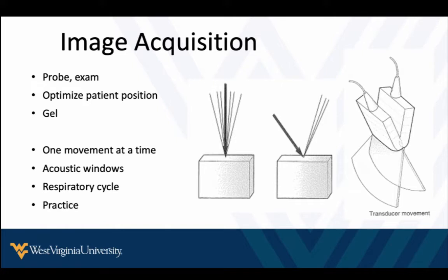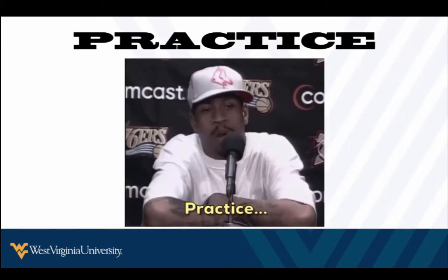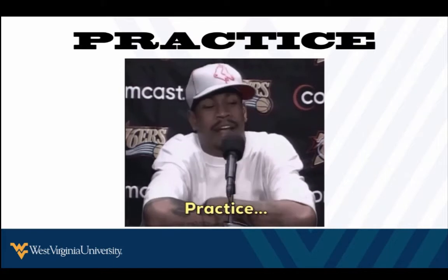But the most important thing is this is a procedural skill, and it's like any other procedure. A lot of times it's compared to playing a video game. You get good at it by doing it repetitively, especially if you can be mindful about how you're doing it and how your hand is moving to affect your image. That's what's going to make you better at this. The less you listen to me really is the better, because the more you practice is what's going to make you better at doing ultrasound.